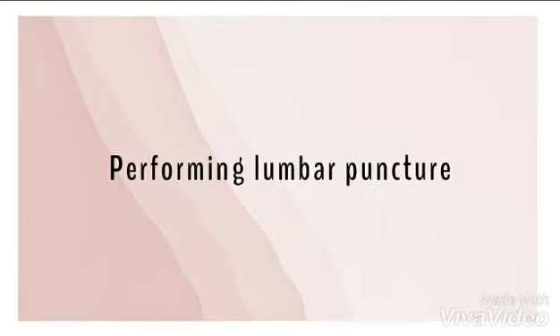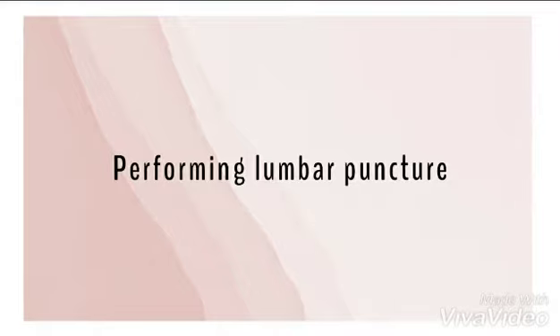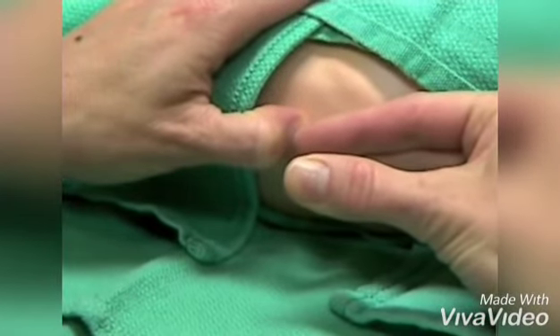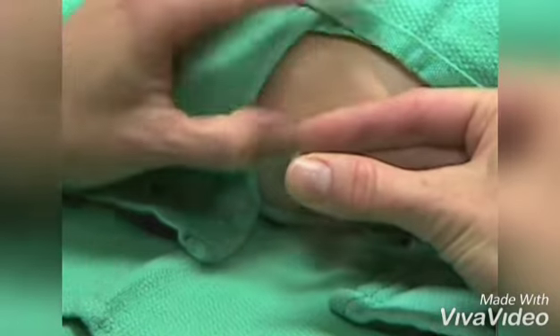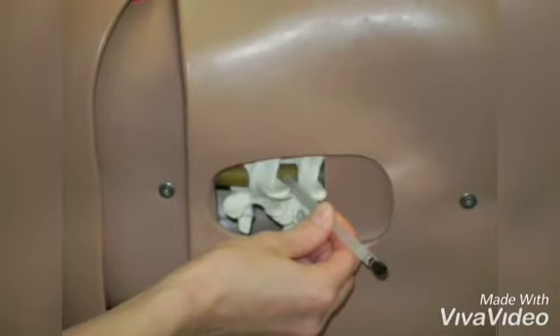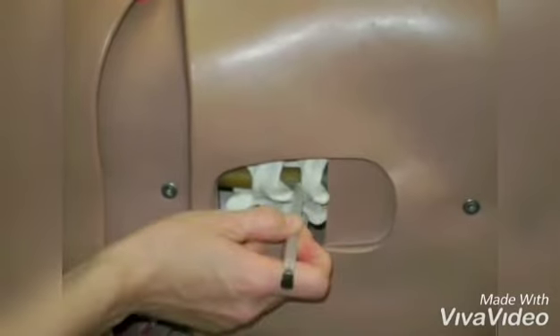Now, it's time to perform the lumbar puncture and obtain the cerebrospinal fluid. Remember that your needle should have a stylet which needs to be in, or else tissue can be pushed into the spinal canal, causing a local reaction. Stabilize your dominant hand on the baby's sacrum and aim towards the umbilicus so that you can pass between the spinous processes. If you go perpendicular into the skin, you are much more likely to hit the bone.